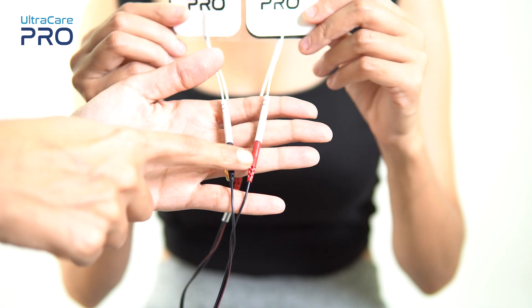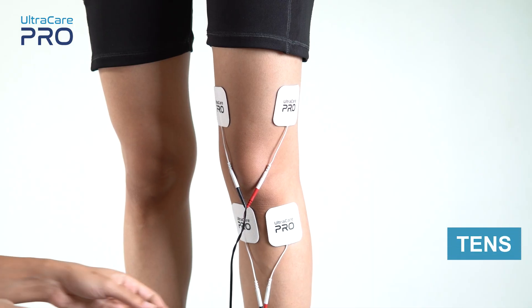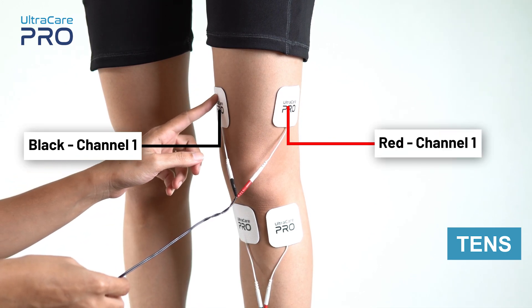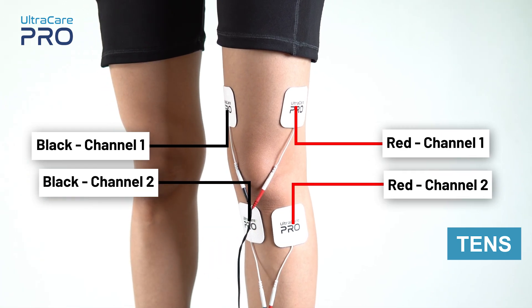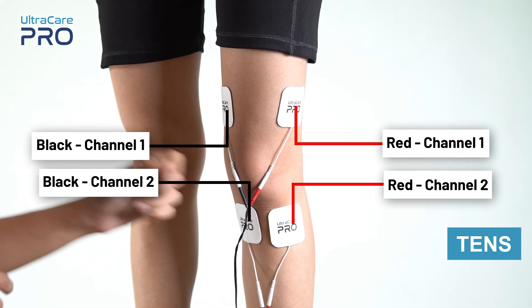Each channel supplies current to two electrodes — one of red color and another of black color. For TENS application, place the red and black electrode from channel 1 on the upper side of the knee joint. Similarly, place the red and black electrode from channel 2 on the lower side of the knee joint. Make sure not to place any electrode on the center of the knee.